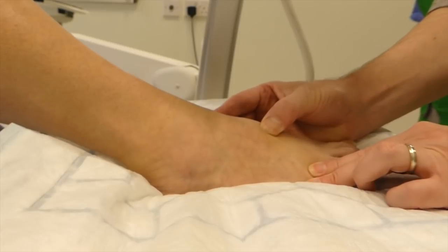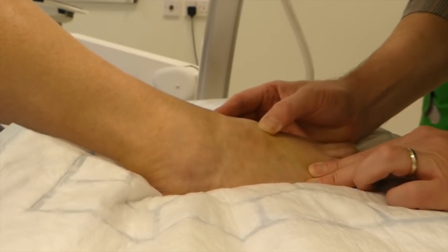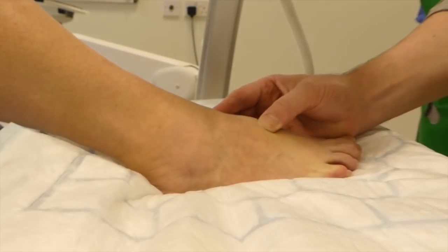We're going to do this under x-ray. So having palpated, we're now going to skin prep.